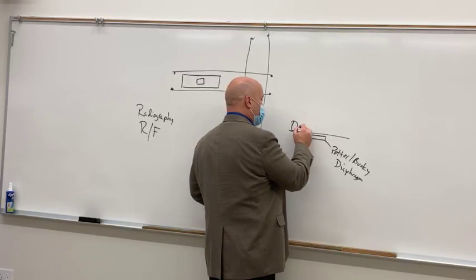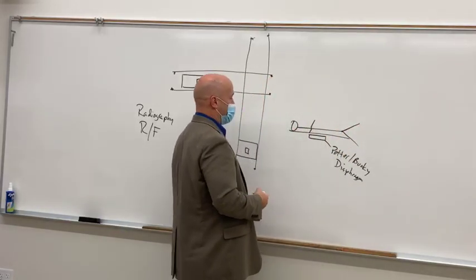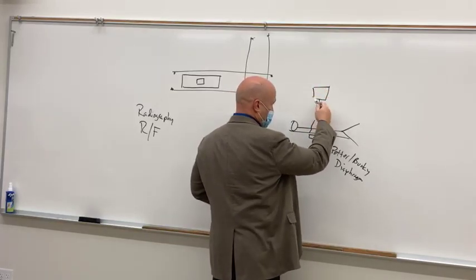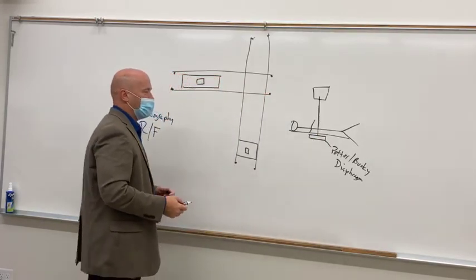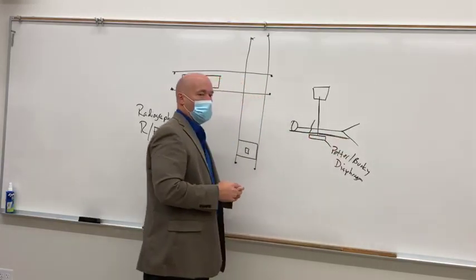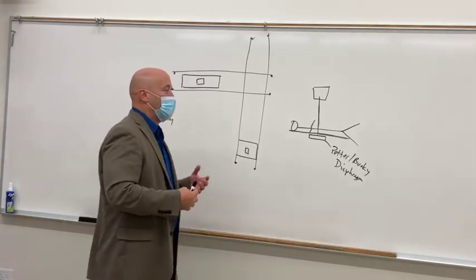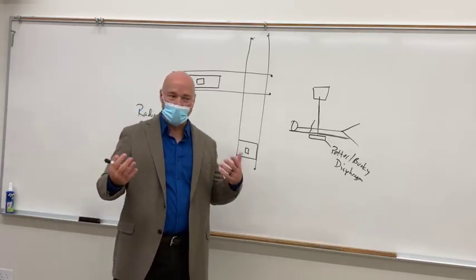But if the patient is here on top of the table, apparently a very tall patient hanging off the table, then our x-ray tube is above the patient, and the x-ray beam has to go through the patient and reach the image receptor. So what characteristics do you suppose that tabletop has to be made of? What's that? Radiolucent. It's got to be radiolucent. Remember, there's not radioparent, but there is radiolucent, and there's degrees of radiolucency.